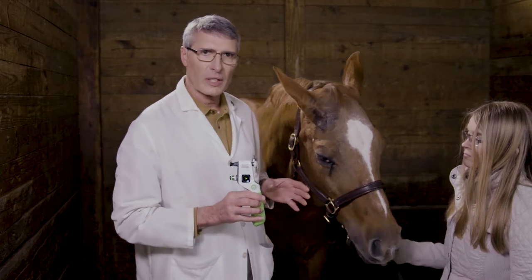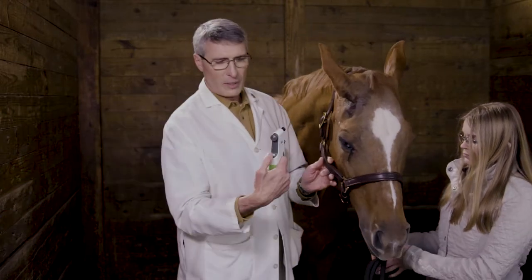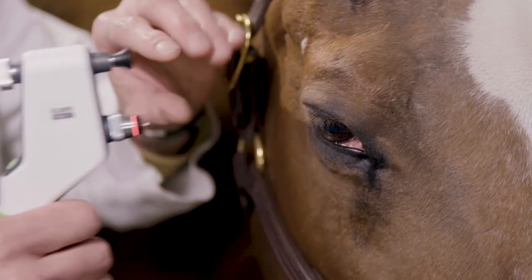I'm now going to take the pressure in the eye. We have a blocked lid, so we're not going to be putting any excessive pressure on the globe. If you had a patient without a blocked lid and they were very blepharospastic or squinty-eyed, you might have to block the lid to avoid excessive pressure on the globe. There's a little activator button on the back. Every time I push the button, it will shoot the pin and it will touch the cornea and bounce back. Because this is so small and so light, we do not have to use topical anesthetic — most patients do not feel this and are very unresponsive to it.